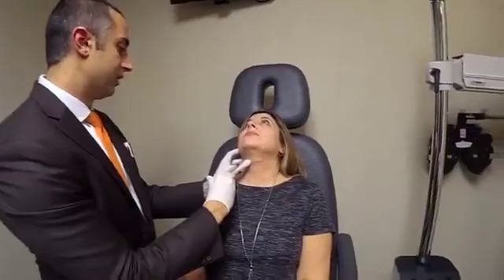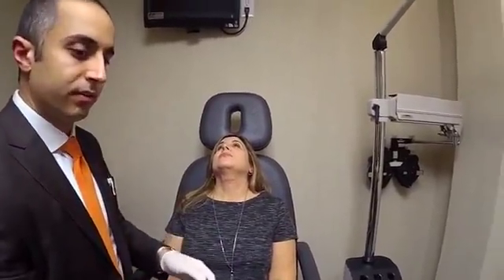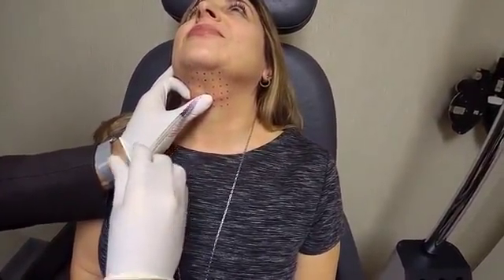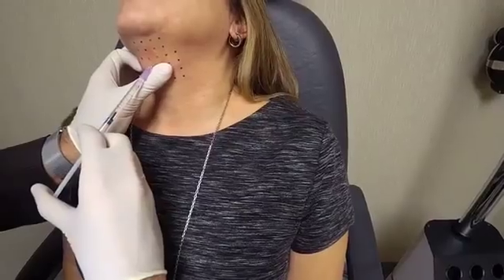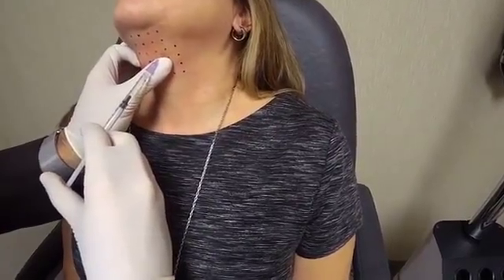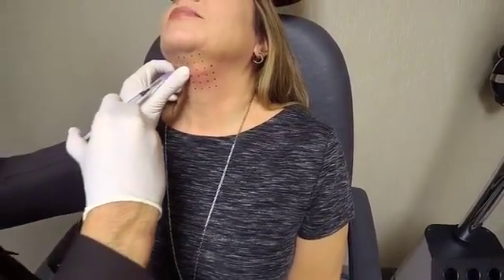Amory, you have that second syringe ready? Mm-hmm. Some people will pinch, some people will inject. I usually go halfway through. Okay, and I'll need another one tracing. Here we go. 1, 2, 3. Doing okay, Gina? Mm-hmm. Awesome. Doing fantastic. On a scale of 1 to 10, how you doing for pain? 2. 2? Okay, great. Sometimes people will start to feel some burning after we do the injections. That's the molecule working and dissolving the fat there. Awesome, and we want to make sure we go deep enough to hit the fat and we don't stay in the skin layer so it doesn't cause any necrosis.